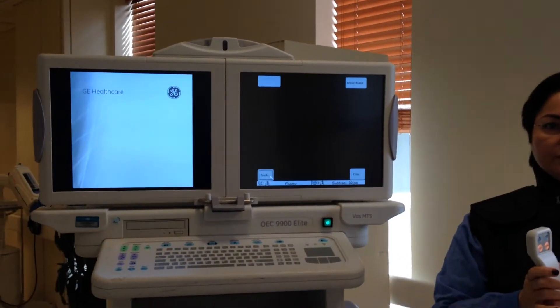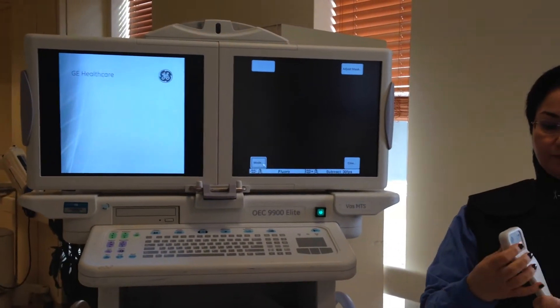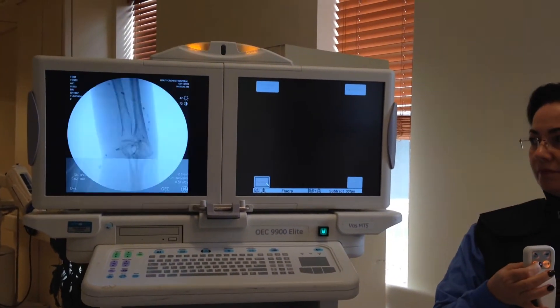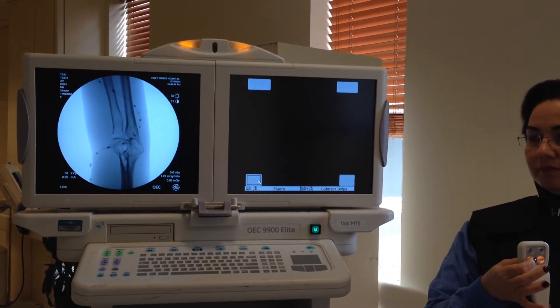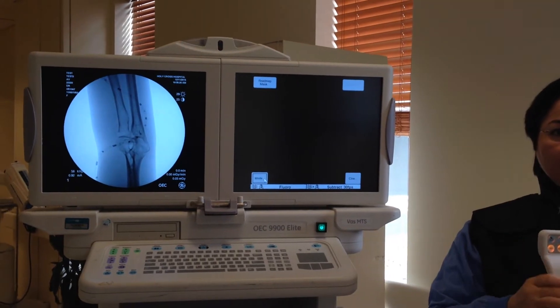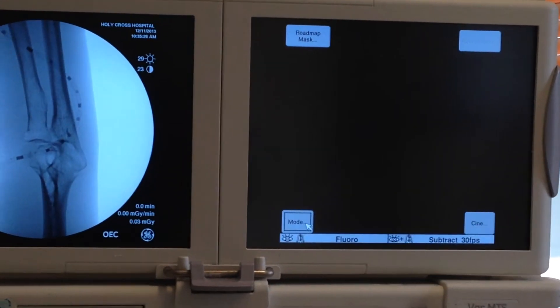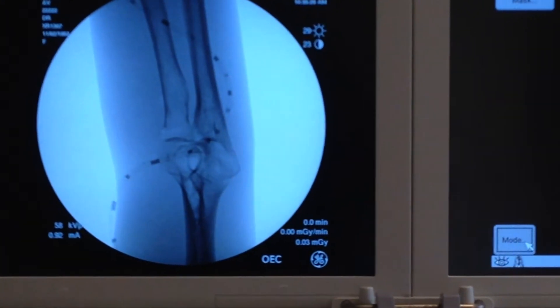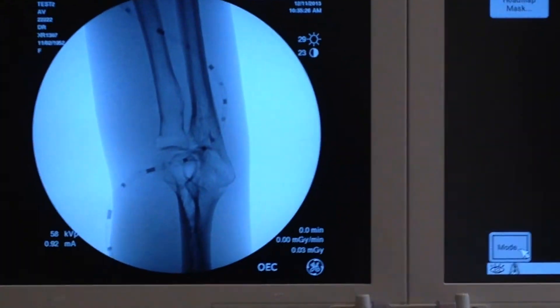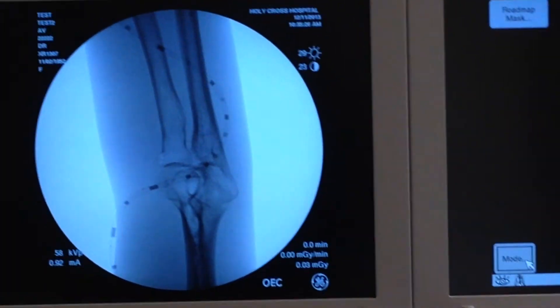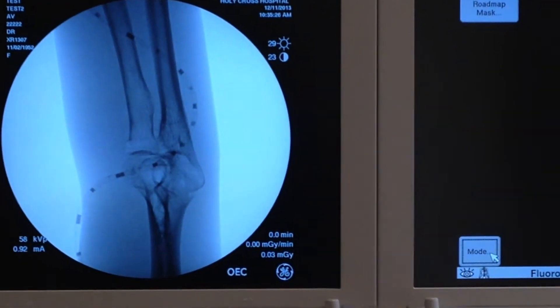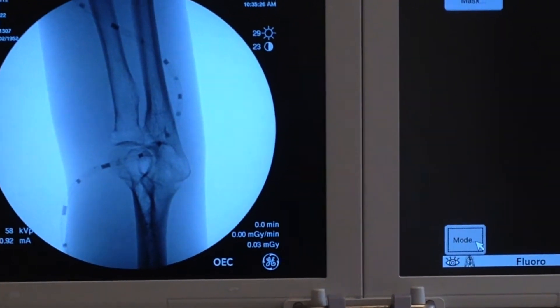Go ahead and fluoro. Now we have the shot and it is the right area, so the doctor is getting ready for injection.